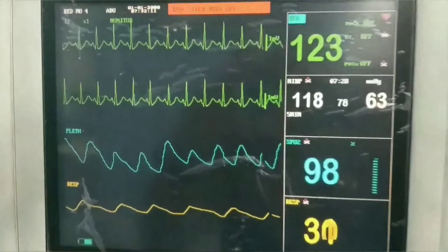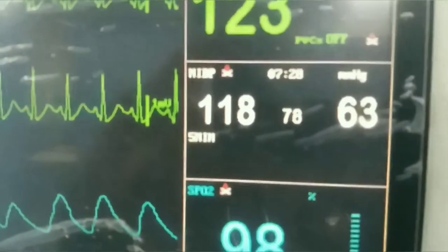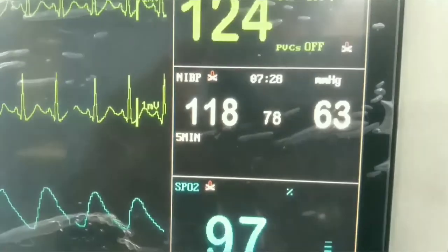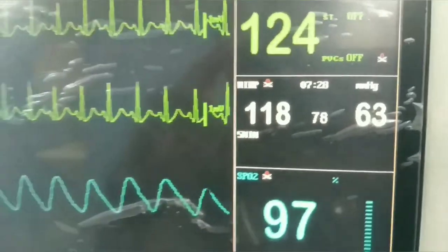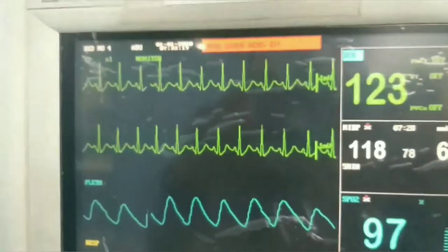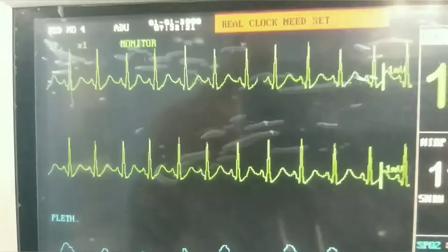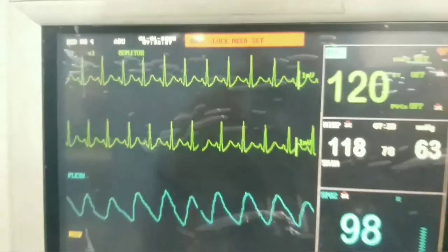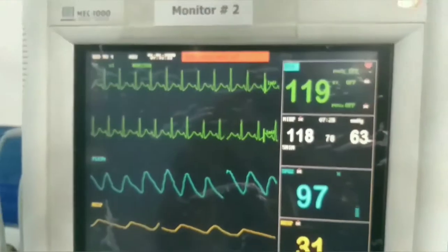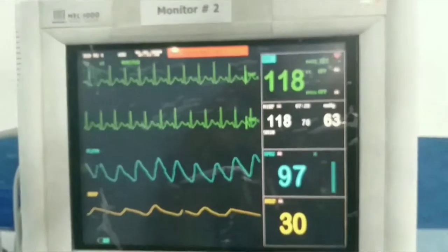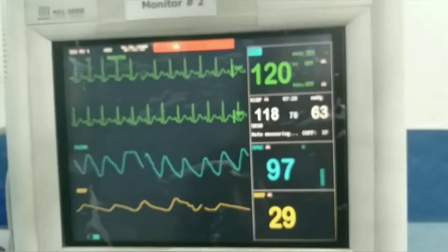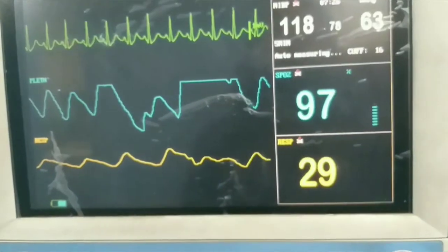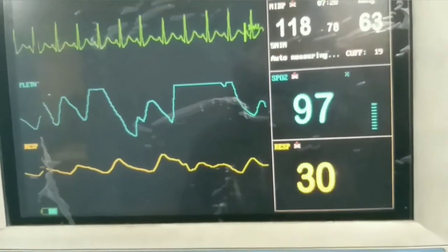This indicates a sinus rhythm — specifically sinus tachycardia. The systolic and diastolic blood pressure and mean of 78 is displayed in millimeters of mercury. These two are the rhythm leads providing continuous display of the ECG rhythm.